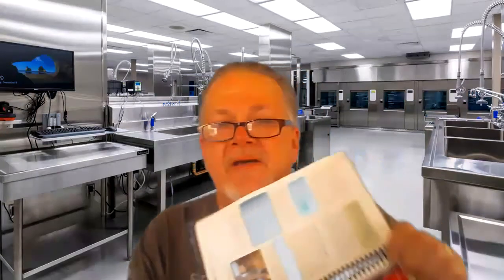So they will come down in the same carts. But sometimes things might come from, say, the emergency department, and they use just a small thoracotomy set or a chest tube insertion set. There's no case cart involved with this. So look at your page 125. You should have these in your department.